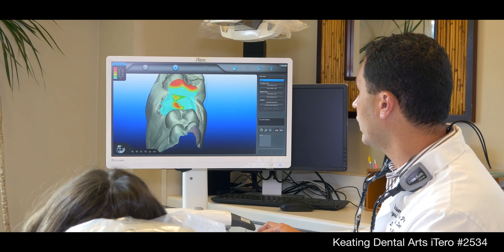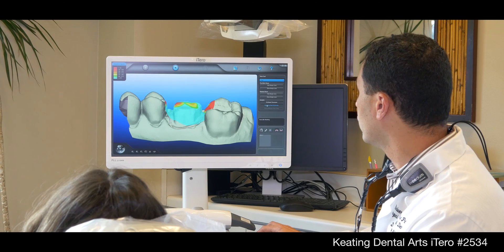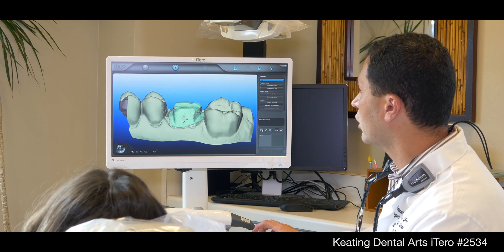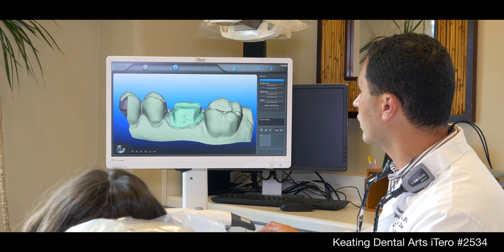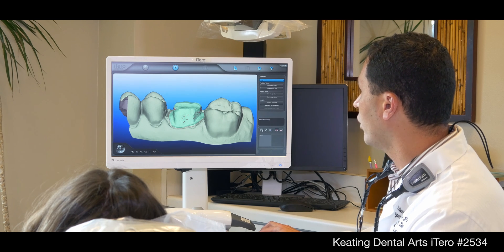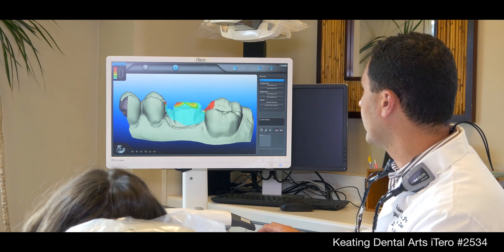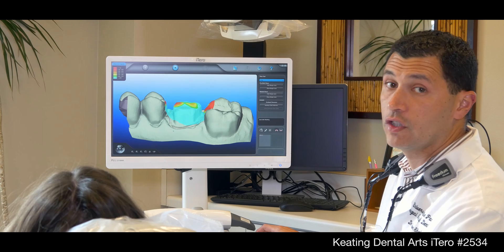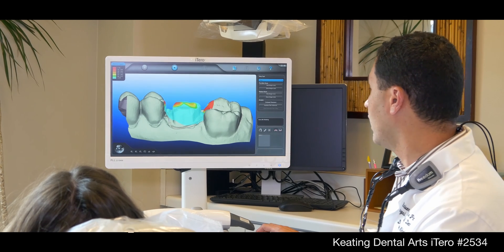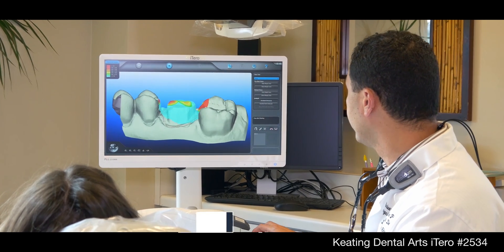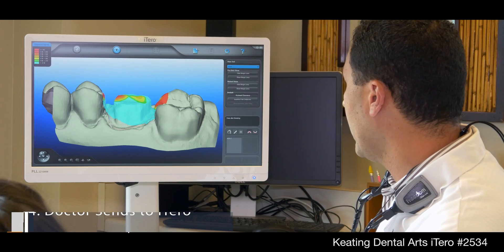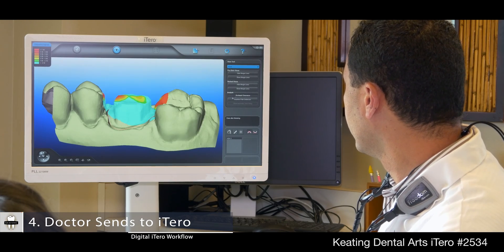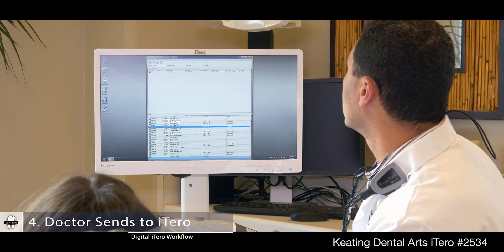One feature that's really neat is the insertion path — it tells you if you have undercuts or areas that you can have any problems with. And then if you like what you see and everything looks good, you go ahead and send it to the lab. So we're going to go ahead and send this one.